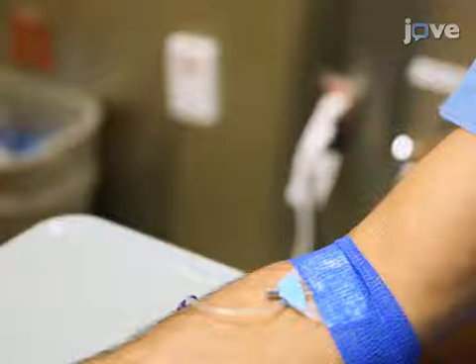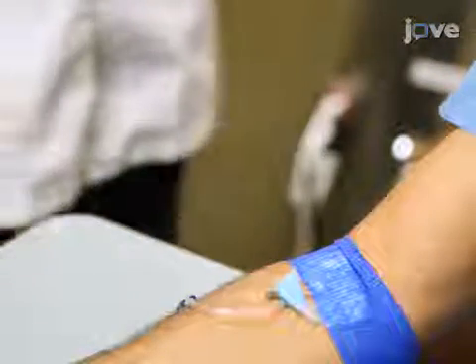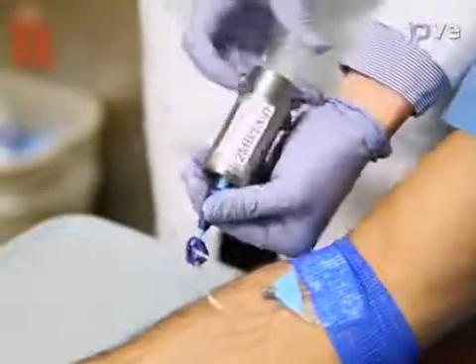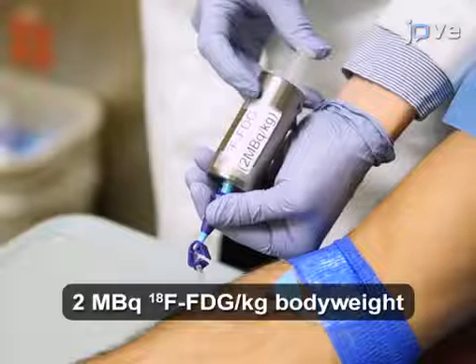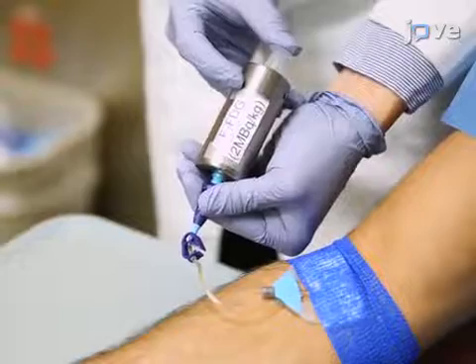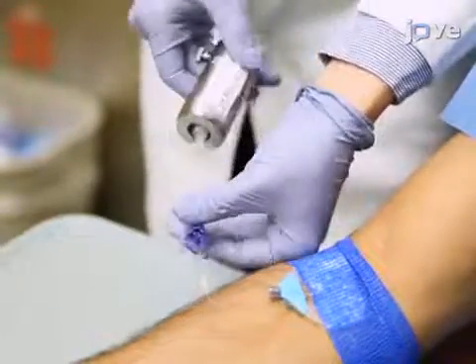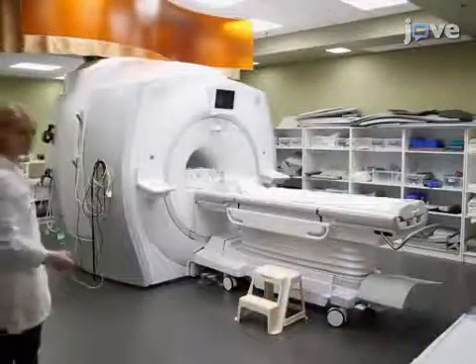45 minutes before the scan, check the patient's blood glucose levels. If the patient's blood glucose levels are below 200 mg per deciliter, administer radiolabeled 2-deoxy-2-fluoro-D-glucose in 1 ml of saline. If the patient's blood glucose levels are above 200 mg per deciliter, consider rescheduling the PET-MRI scan.